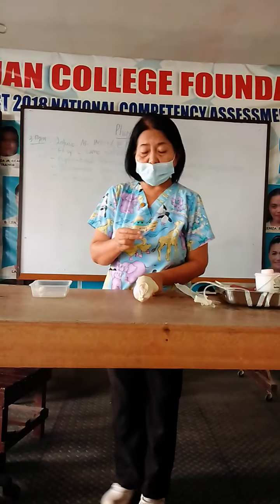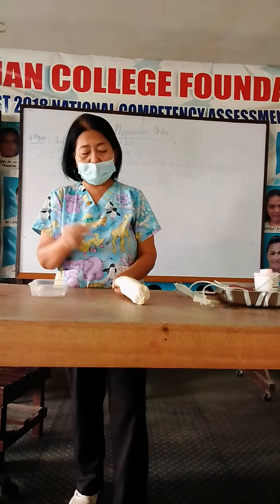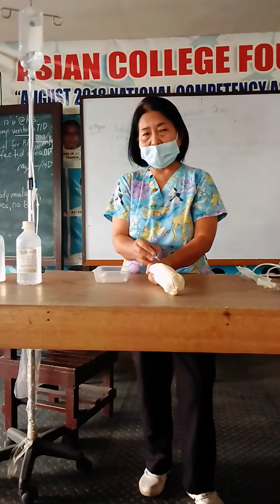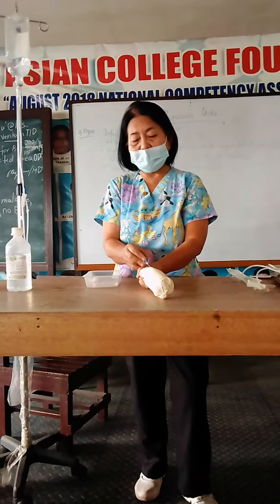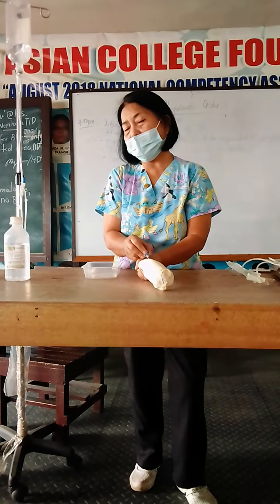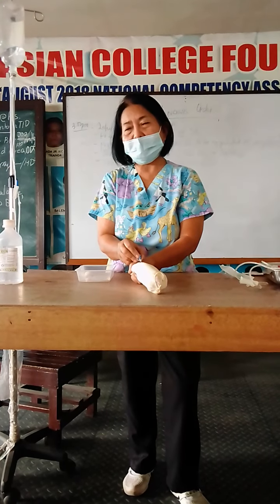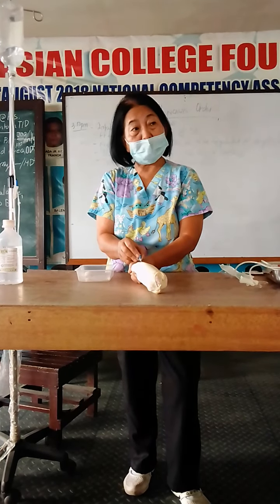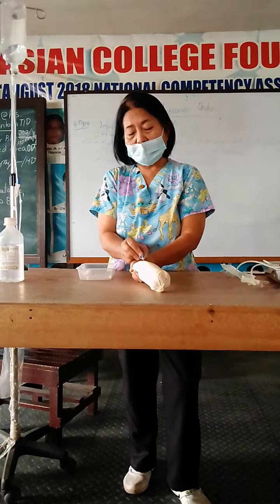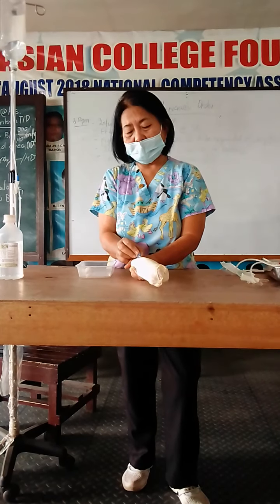And then the bevel of the needle should always be facing you, class. Facing you. And when you insert, you start with how many angle, class? 15. Then after the 15, you can feel it, you cannot hear it actually, but you can feel it. It will do like that. You can feel the look. So you already hit the vein. After the 15, it is in, then straight.